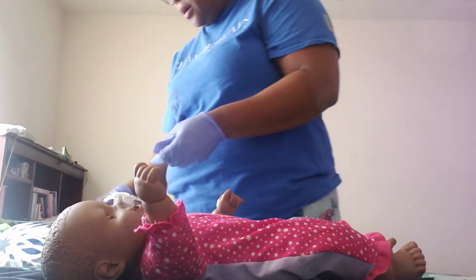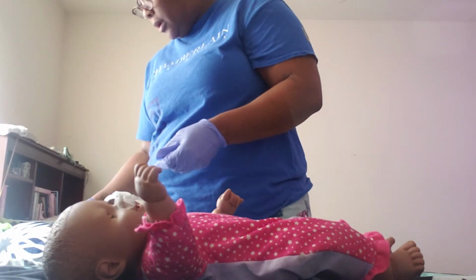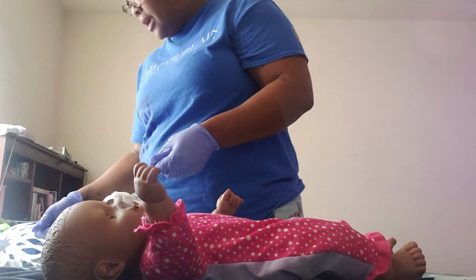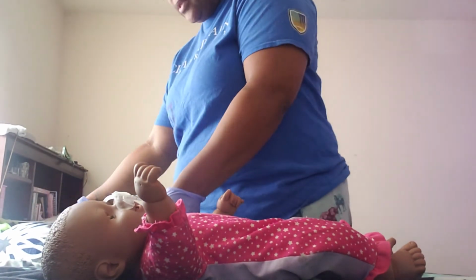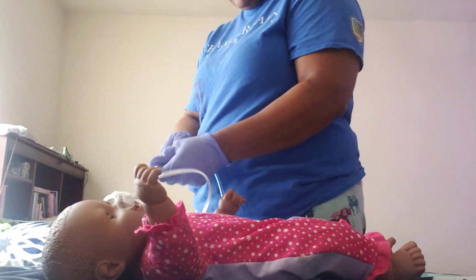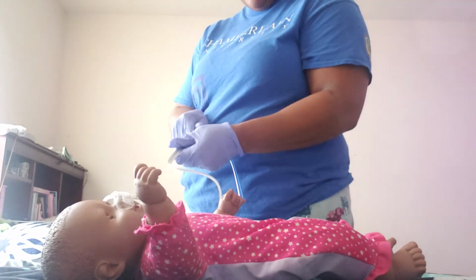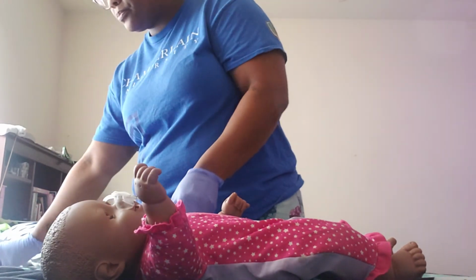And I will put it on the pH paper to see if it's gastric juices there. It is acidic. So then I will take the tube and put it back inside my patient.